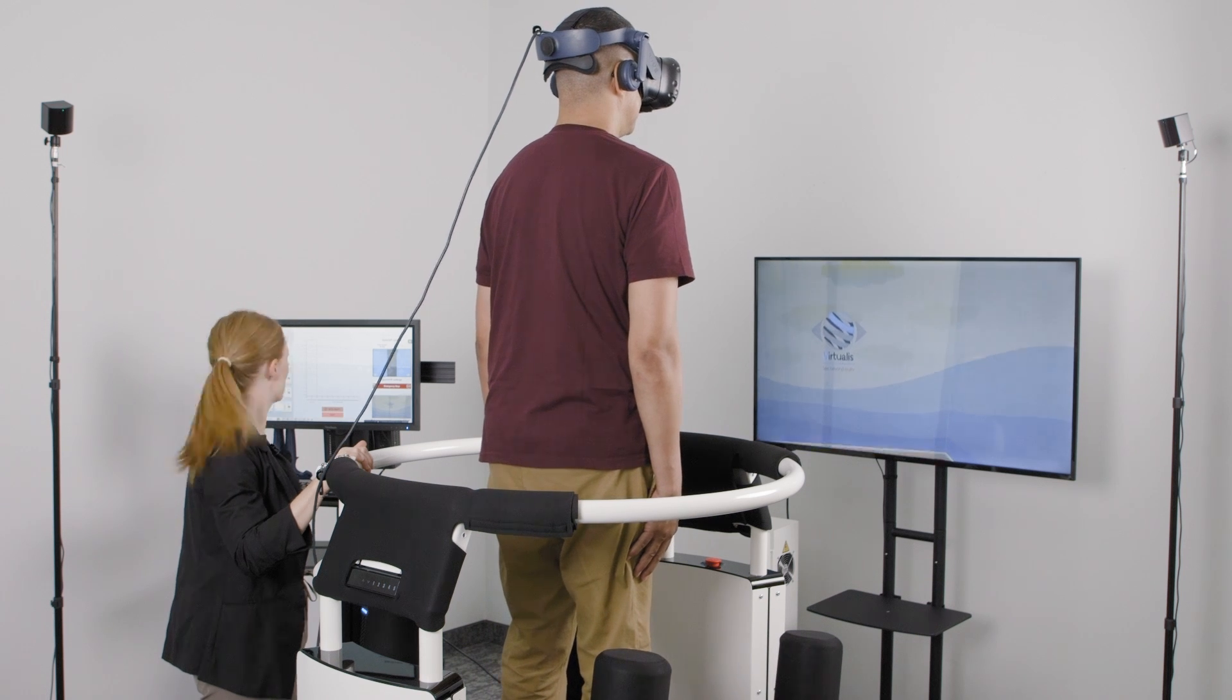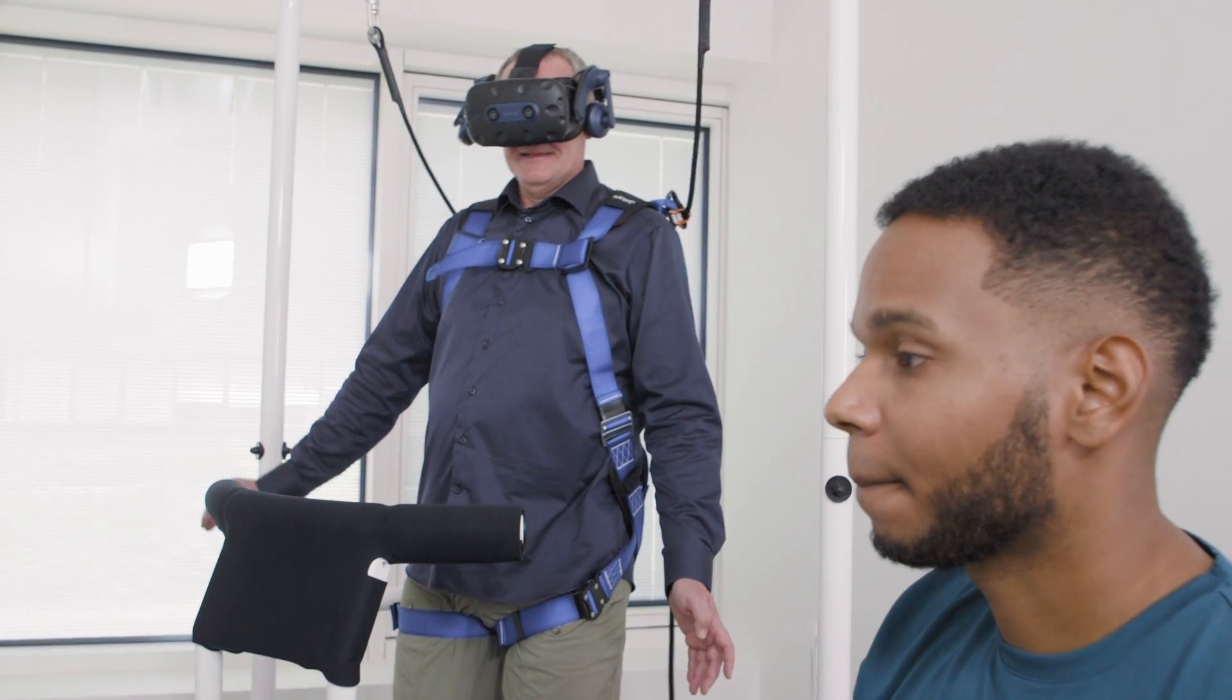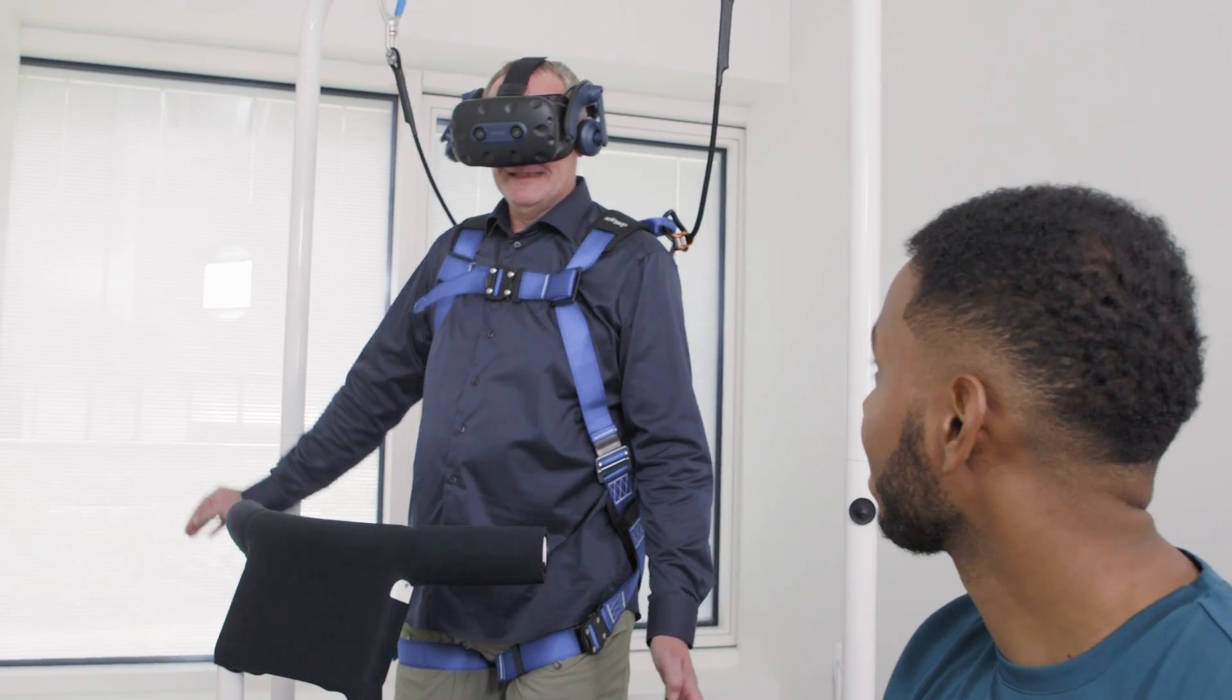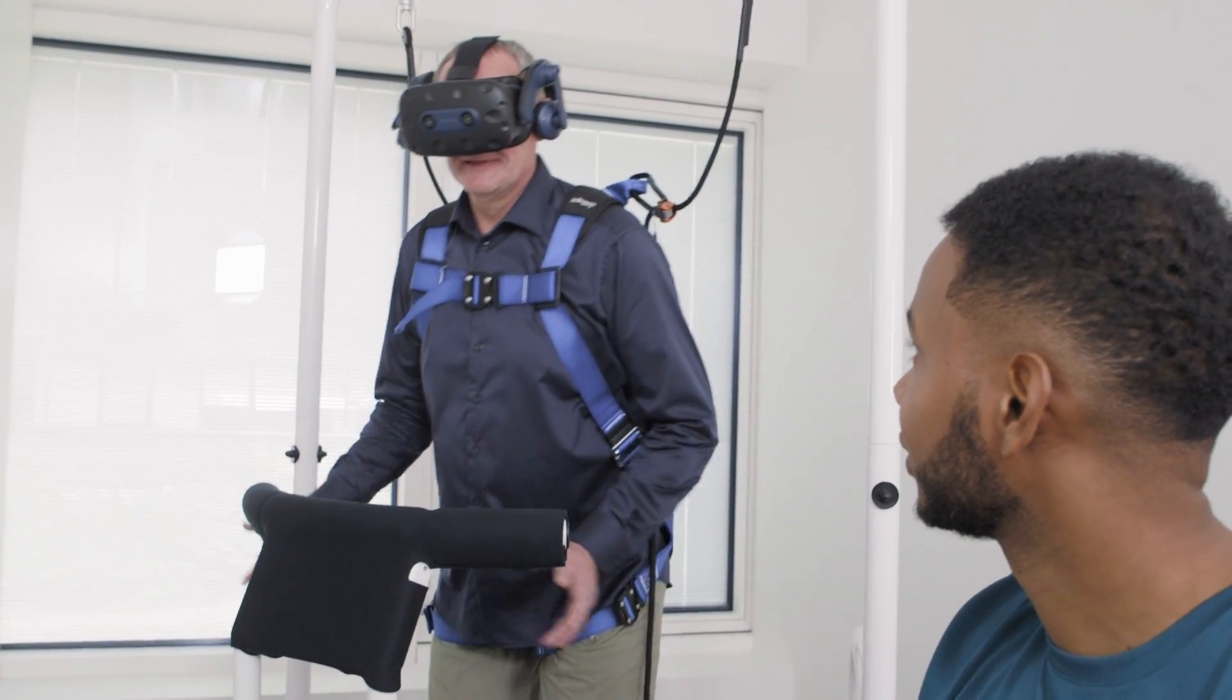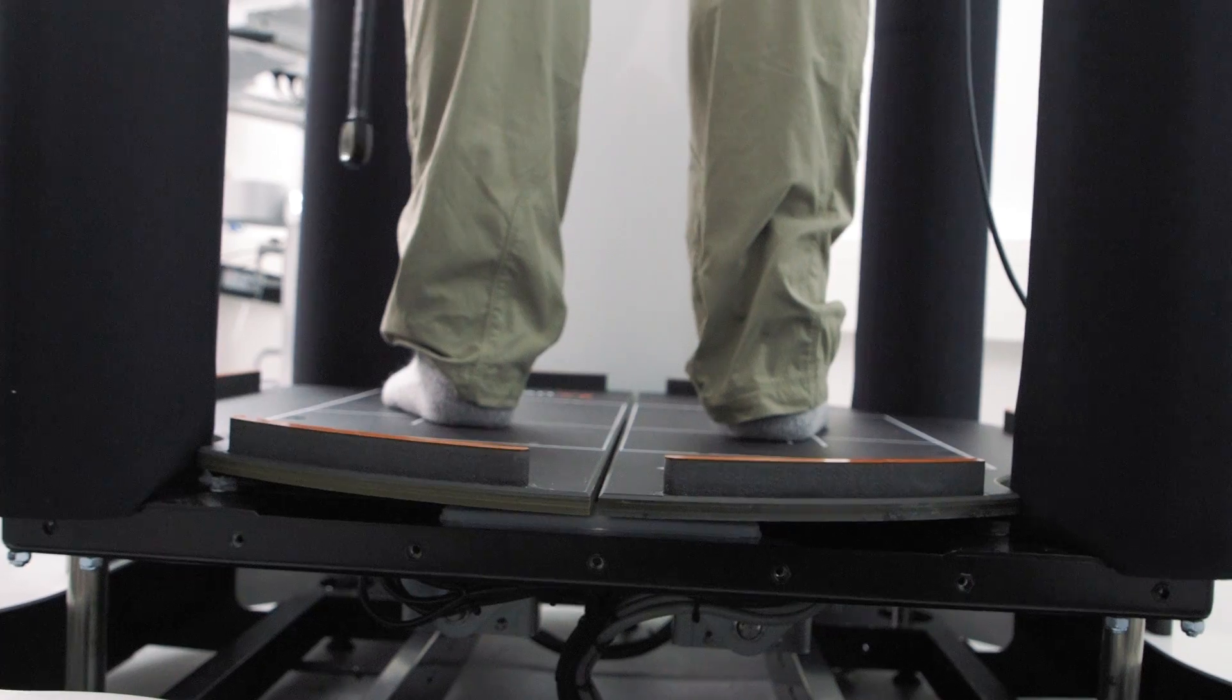With real-time feedback, you can personalize the exercises and safely train your patient to their limits to help them rehabilitate their balance in the most efficient way.